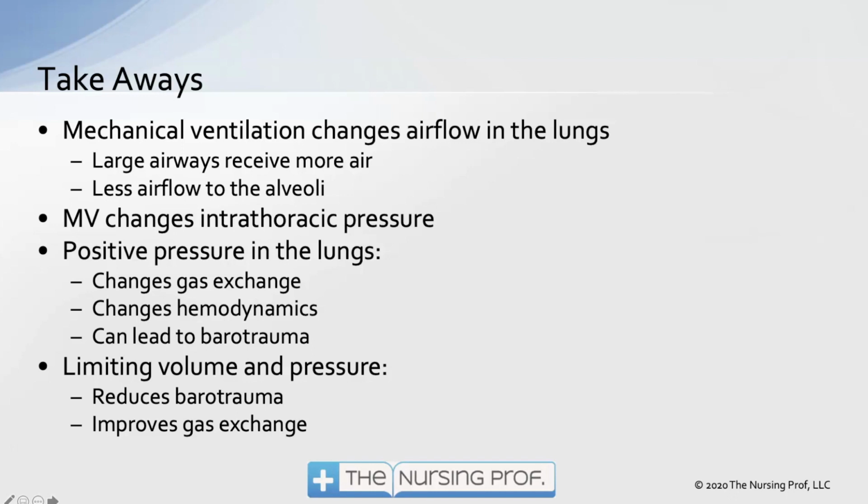By limiting our volume and pressure, we can reduce barotrauma and improve our gas exchange, and that's why pressure control ventilation and pressure-regulated volume control ventilation are such popular alternatives.